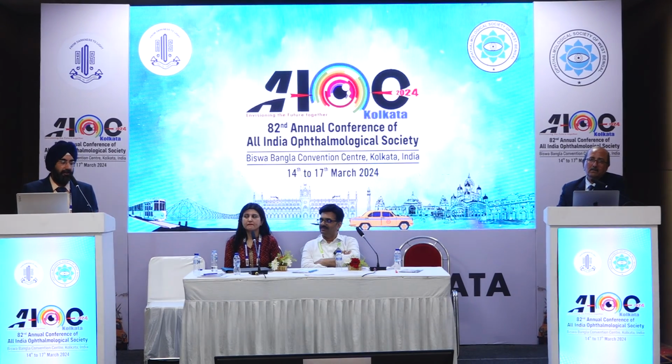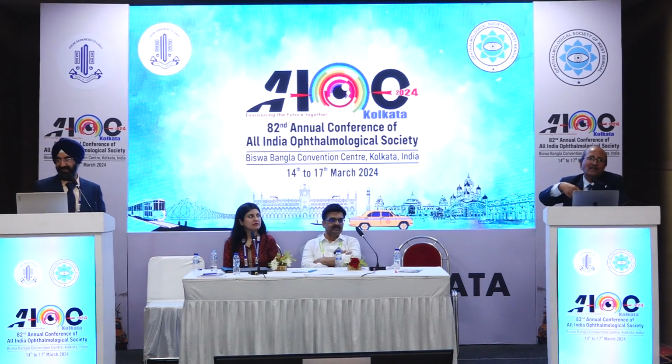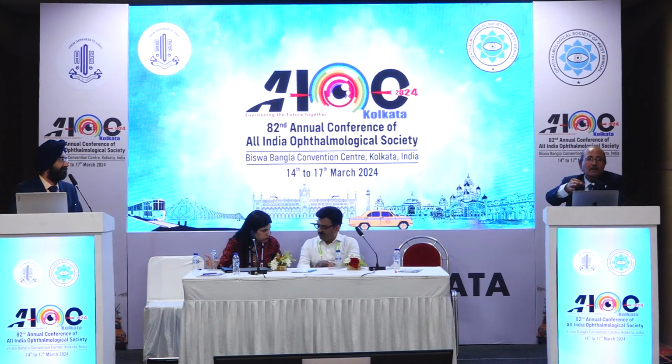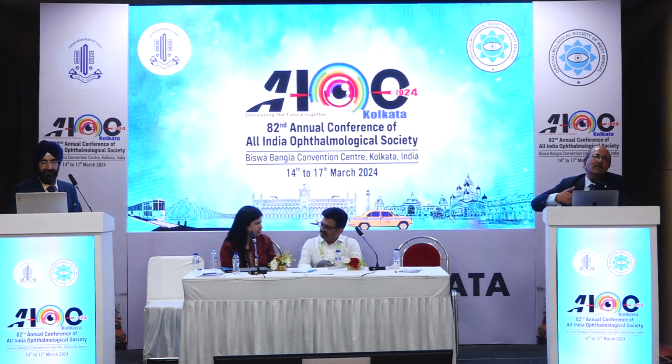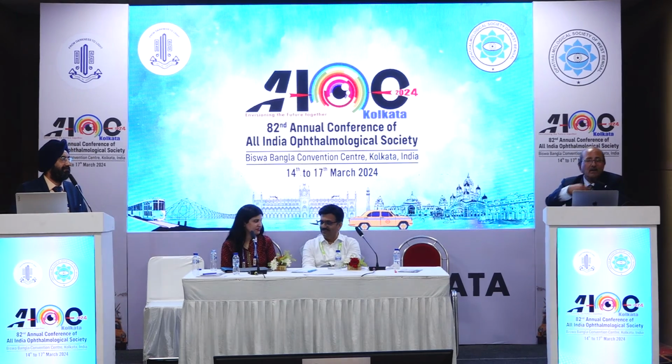Yes, in Western countries, people usually follow that and go through the pars plana. But obviously, what is good in your hands is best. I think that can be done with the vitrectomy cutter. You can do primary posterior capsulotomy also. Usually we do it with the Utrata forceps with the initial nick with the needle cystitome. But if you fail, we are not 100% successful, in that situation you can use the vitrectomy cutter. That is another safe way, because it will also provide an equally good opening.